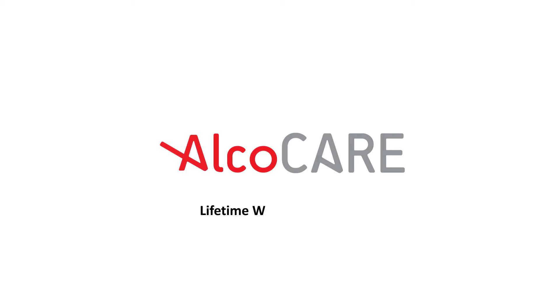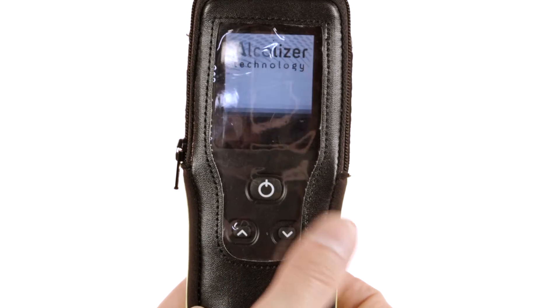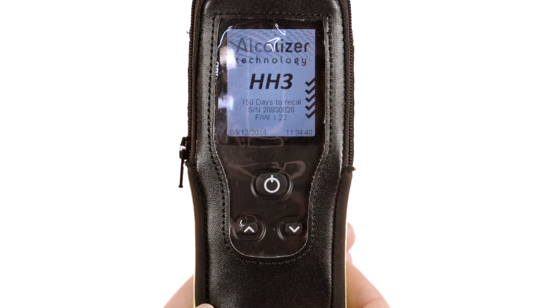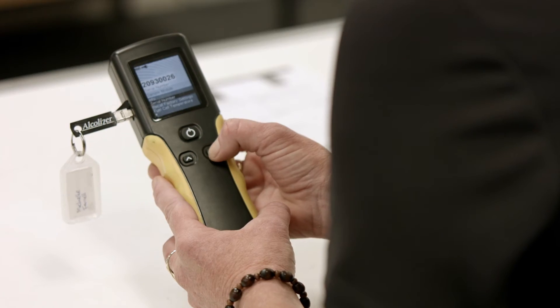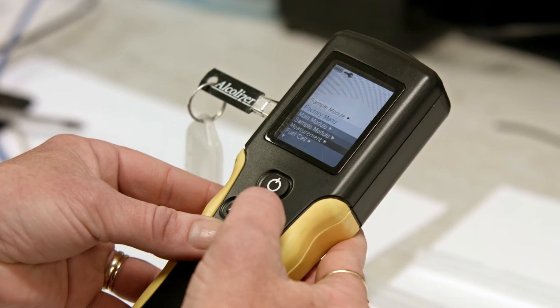To maintain Australian standards, the HH3 needs to be calibrated every six months. Upon startup, the instrument displays the number of days to calibration due. The instrument can be returned to your nearest Alkalizer Technology service centre for calibration.